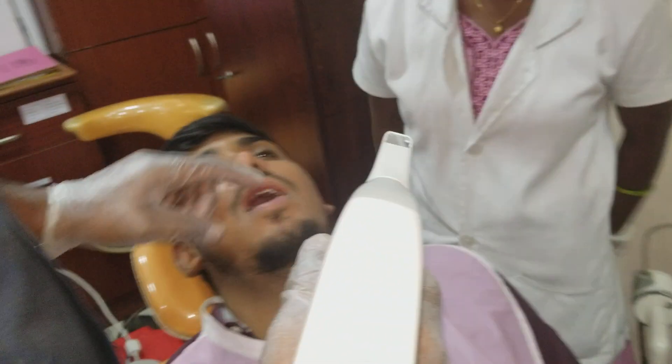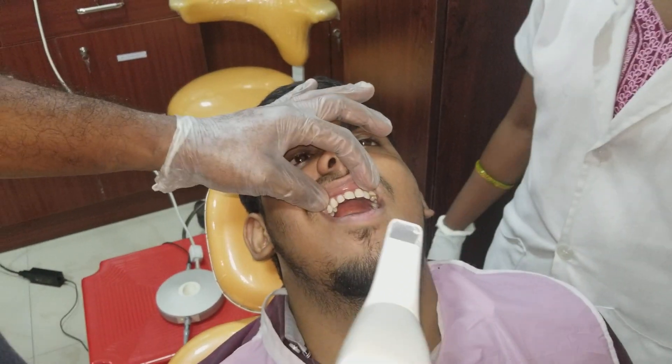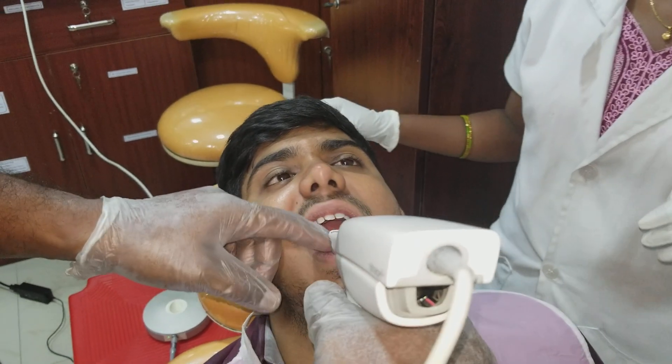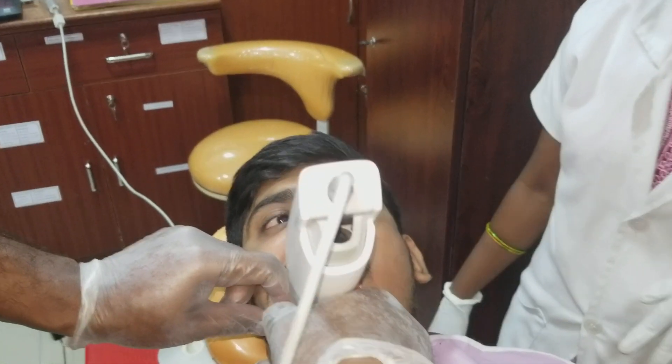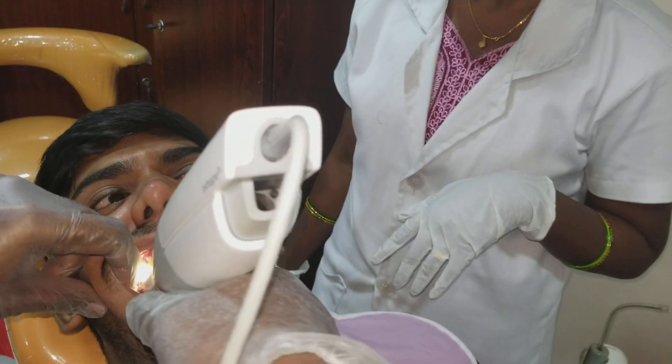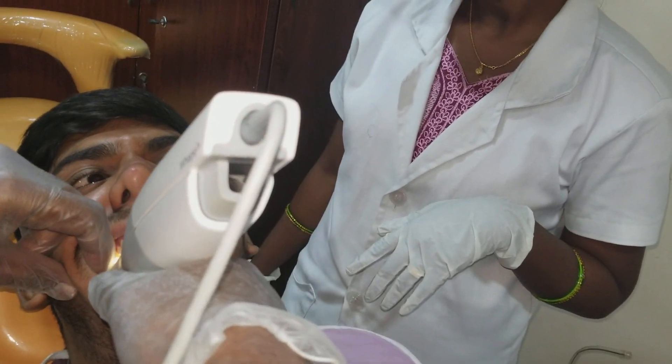We are going to see both the viewer and the patient. The patient is prepared after cleaning, and we are going to start with the impressions. So let's open, sir.